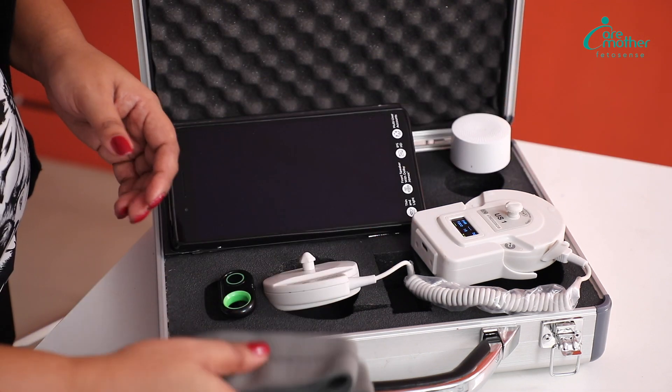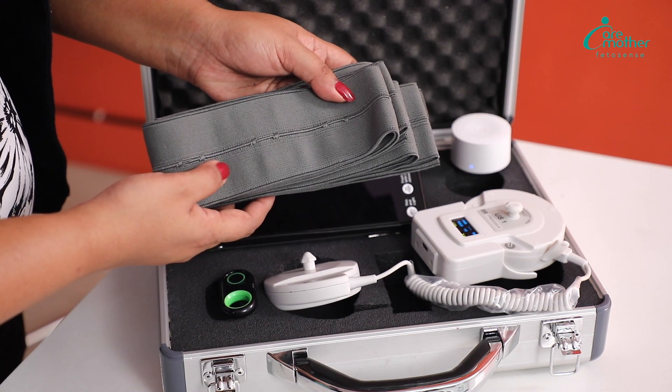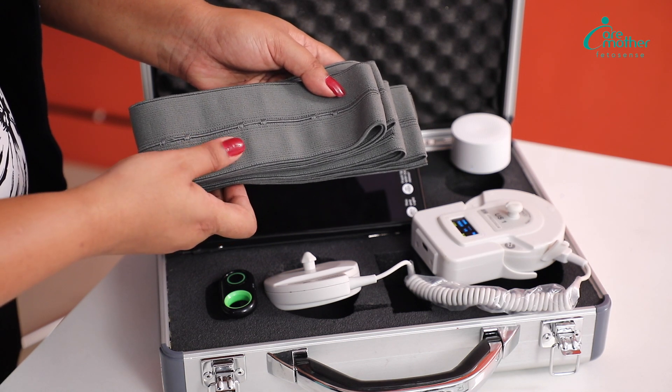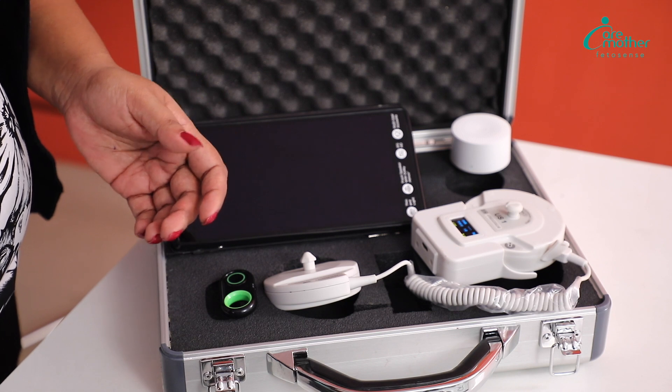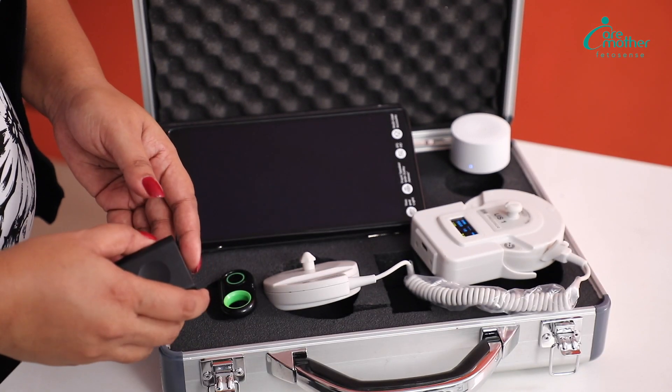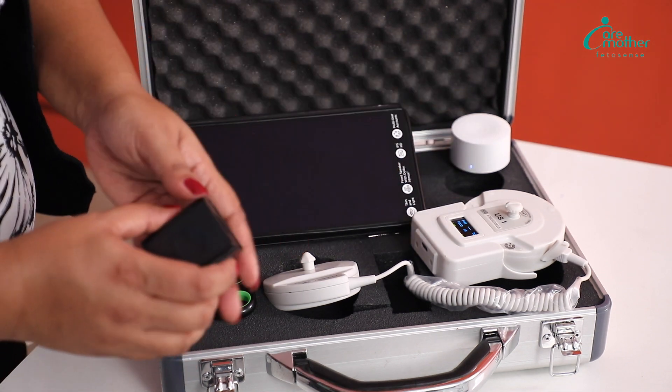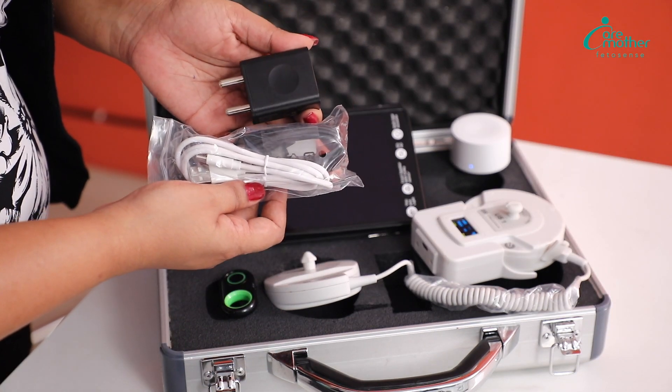This kit also comes with two belts, which are used to strap the probes to the mother's belly. Additionally, some device components need charging — namely the tab, the probe, and the speaker. For that, we provide you some cables and a charger.